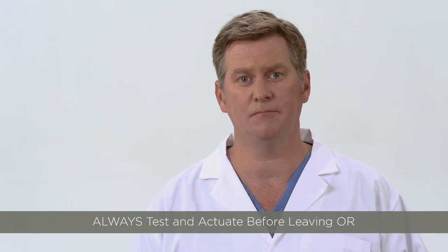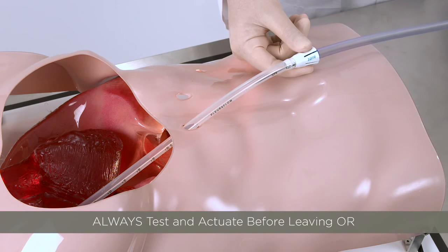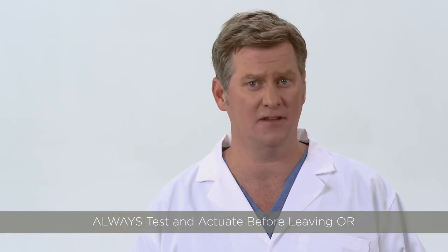As a final test, before the patient leaves the operating room, simply actuate the clearance wire and loop to make sure it can travel smoothly through the chest tube. This will ensure that the PleuraFlow system is functioning as intended before the patient is transferred to the ICU. If any obstruction is noted, it can quickly be addressed before the patient leaves the operating room.